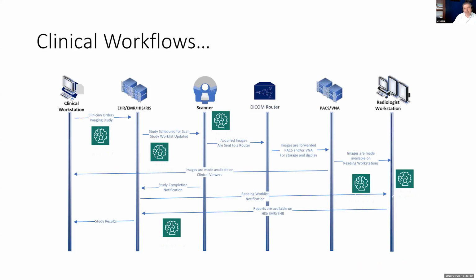So if we look at the traditional clinical workflows, this is not comprehensive. What we're showing here is more of a collection of average of events that are happening within our participating institutions.